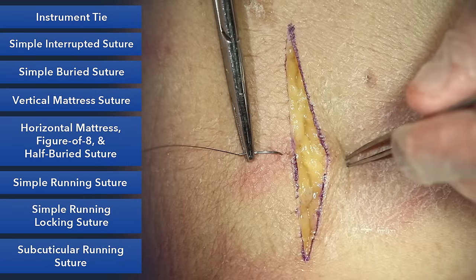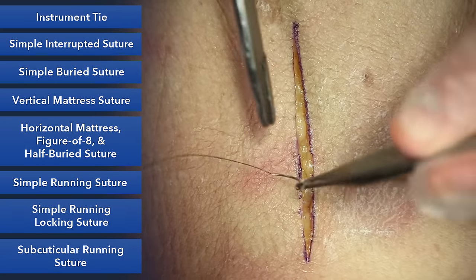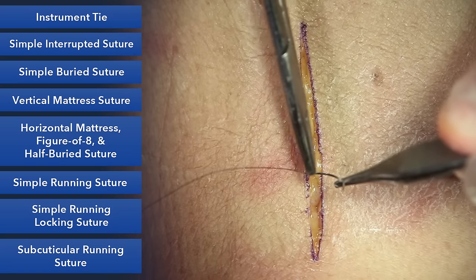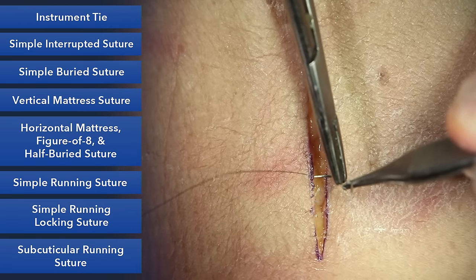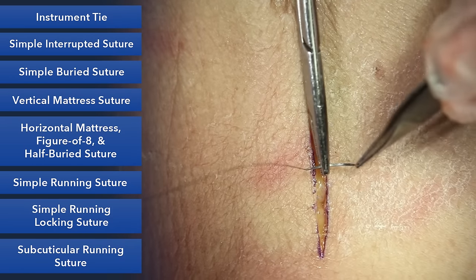The first suture we're going to teach you is the simple interrupted suture. This is the most common suture that you'll be using in wound closure. Just a quick tip on handling the needle. You'll notice your needle has a flat portion in the middle. This is where you grab the needle with your needle driver.